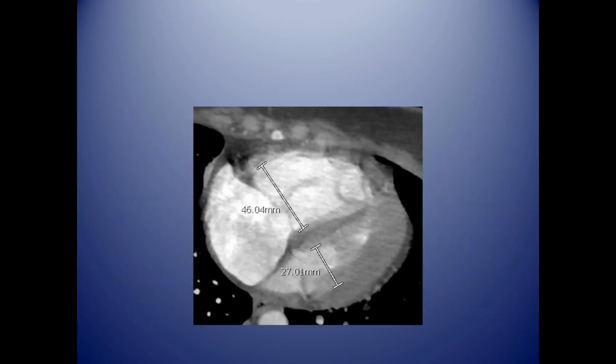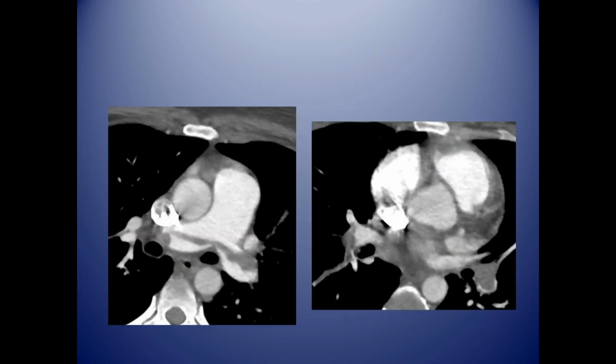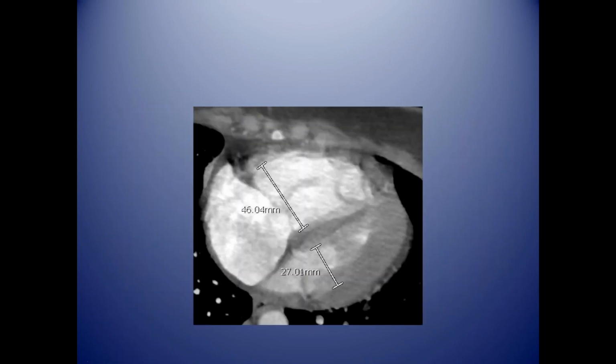And so this is the imaging, a couple slices through the patient's CT angiogram. You'll see the saddle pulmonary embolism and then obstructive pulmonary thrombus really into both the right and left pulmonary arteries. And here you have the four-chambered view, which is easily seen on a CT scan. Here's your RV and here's your LV, and you can see that that's your ratio of 1.7. And really, you don't need calipers for this to know that this is significantly increased RV diameter compared with the LV.